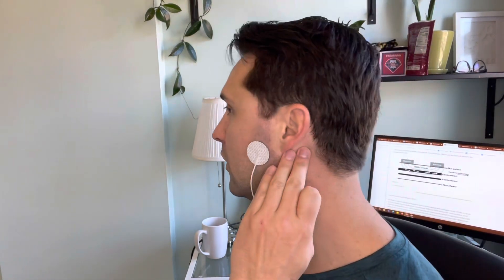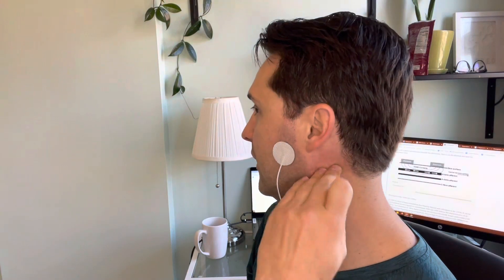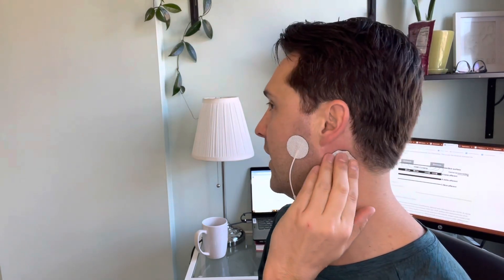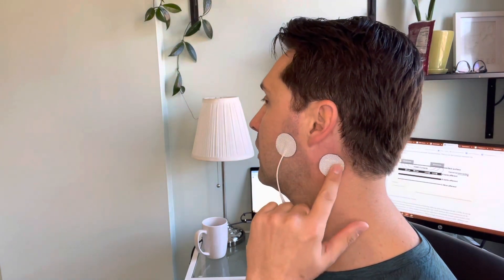For jaw and neck pain, place one electrode at the jaw and another right where the mastoid process is — where the sternocleidomastoid muscle inserts, just behind the ear where you'll feel that bony prominence. A lot of people with neck pain, this is one of the targeted areas we try to get.